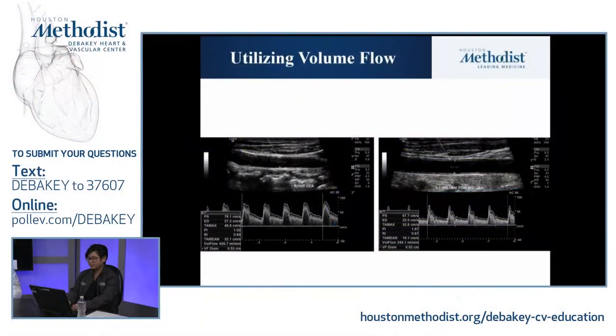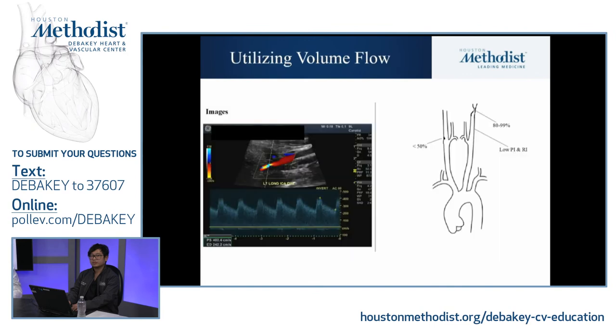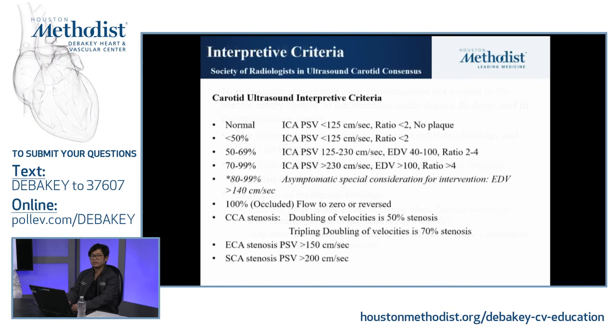Yes. Besides the criteria that we use here, here is your flow volume. Yeah, the flow volume. Very good. So this is the last step before you switch to the other side, and you can go back and show us the criteria. So this is the criteria we're talking about, and I think it's very important. We'll keep it on for a while, because we're going to switch to another computer where we can show.